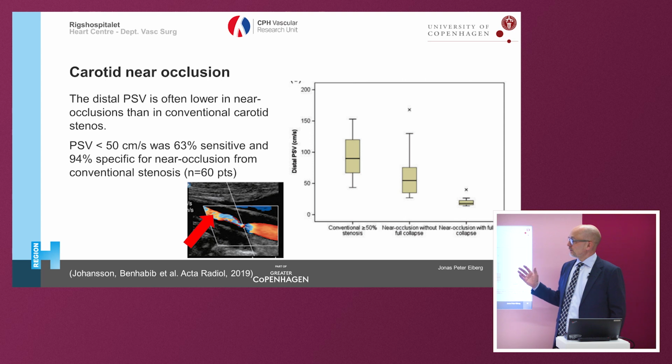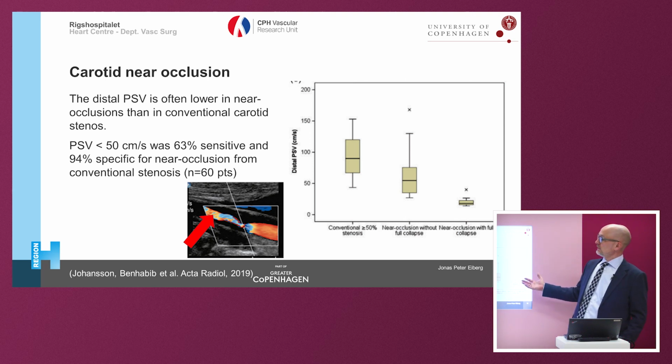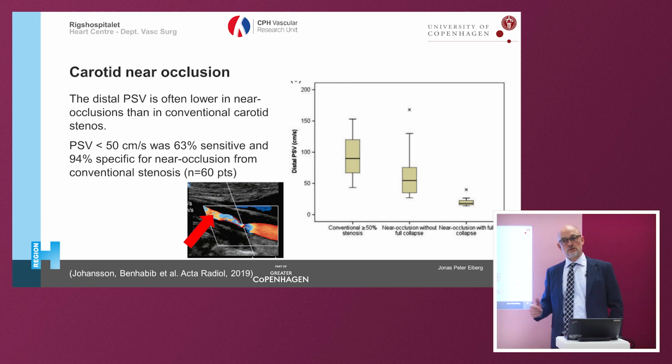We believe that we can learn most to do basic carotid ultrasound, meaning is there a significant stenosis or not, in a way so it has to be reconfirmed by a more experienced sonographer. I'm not teaching you now to do ultrasound so you can go home to your own shop and just use ultrasound to decide if this patient should be operated on or not. We believe that you should do 200, 300 supervised examinations before you can take that decision. At least that is the demand for our nurses.